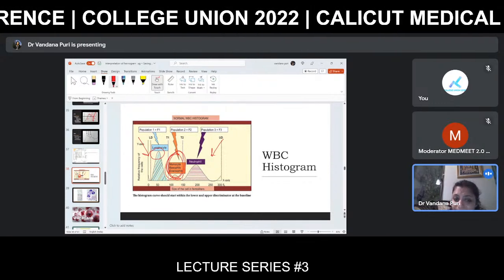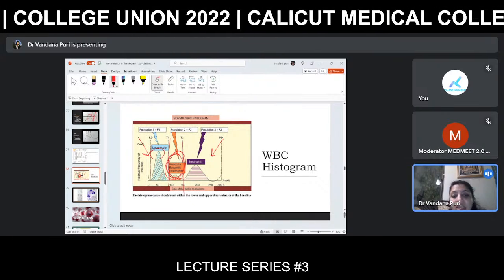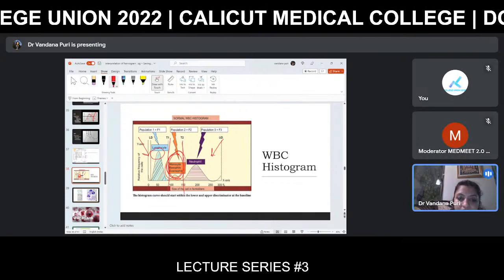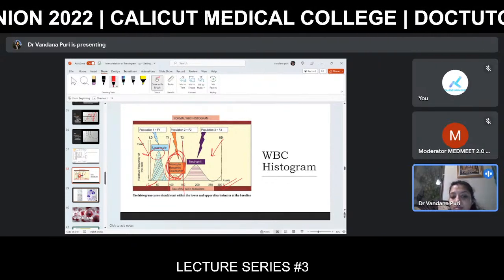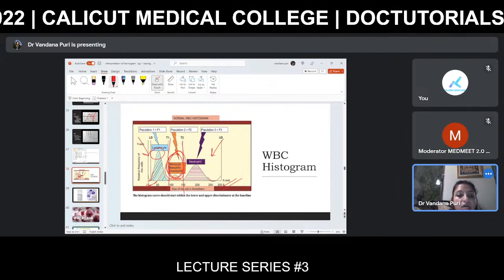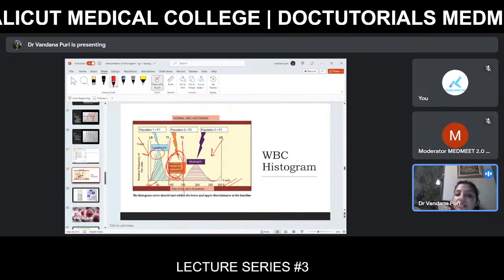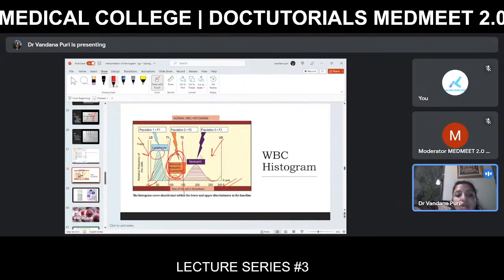Now, obviously, there is a trough which divides these two, T1 and T2. And then we have a lower discriminator and an upper discriminator, which you should remember. And it should always start from the baseline. That is another point you all have to remember. So this is the smallest population, called F1. This is the mid population, called F2. And this bigger population is called F3.